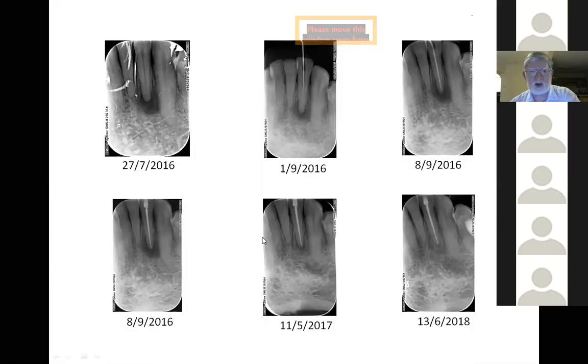So here we've taken the PA of the 4-2, showing a distinct periapical abscess. Something I'll show you particularly for the students is that you might do endodontic treatment on this patient. Here we're doing CMP on that visit.